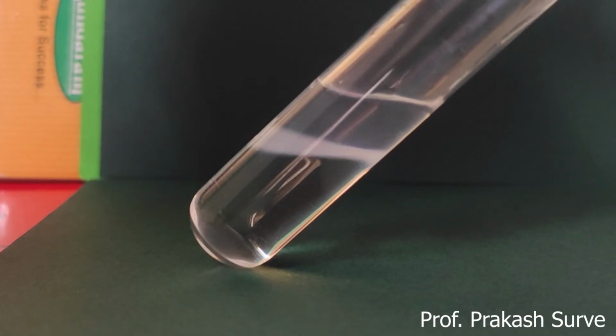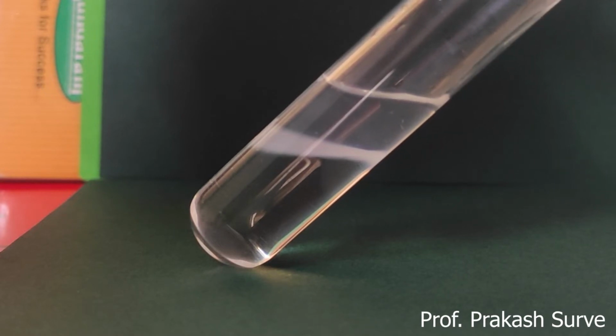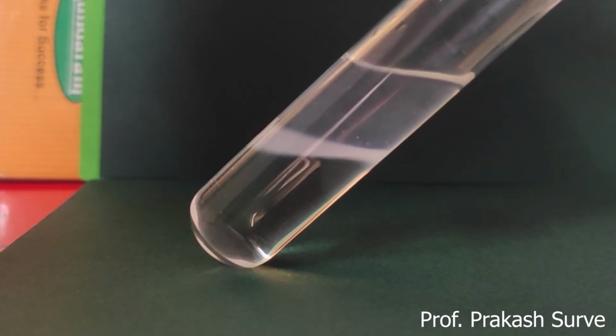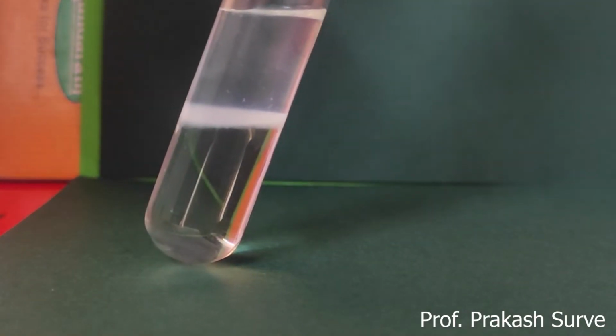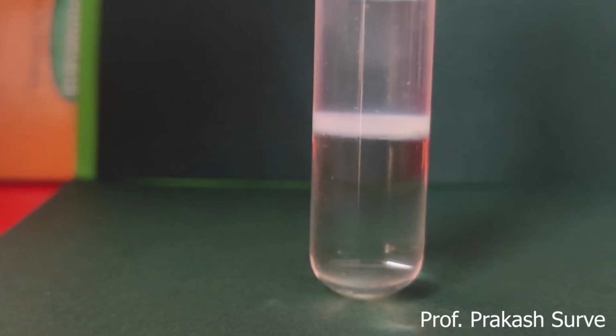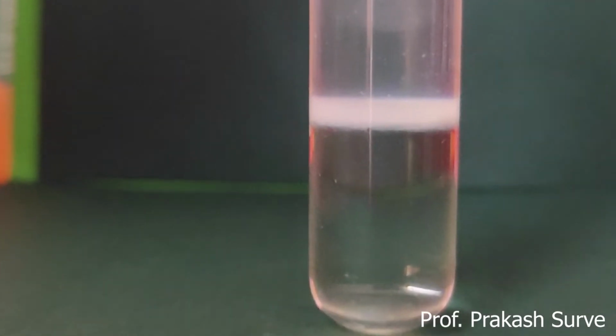Same quantity you have to add in this. Slowly you have to release. What we find here is a white cloudy ring at the junction of the two liquids. This white cloudy ring indicates the presence of albumin in this urine sample.